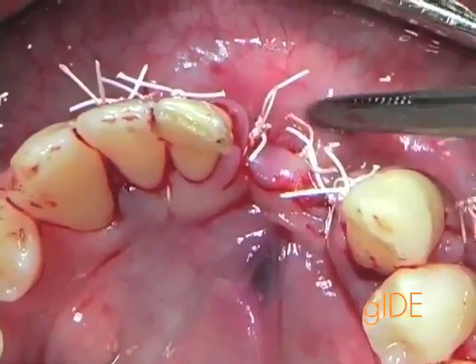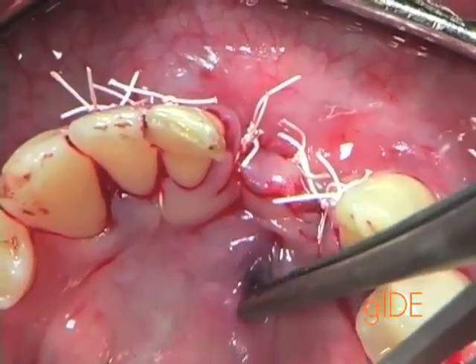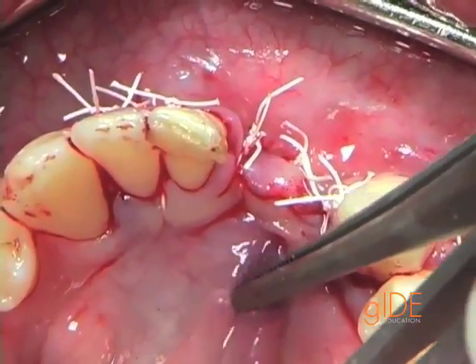Occlusally, you can see the nice eversion of the flap, and how there is nothing exposed — completely submerged.